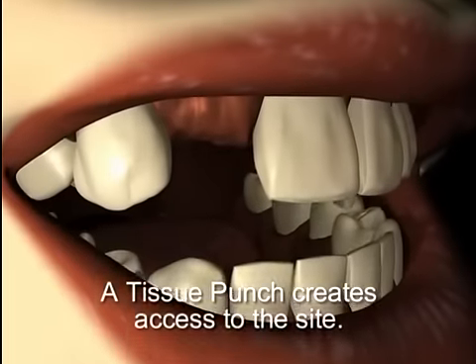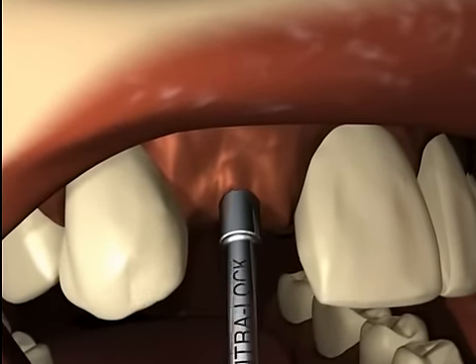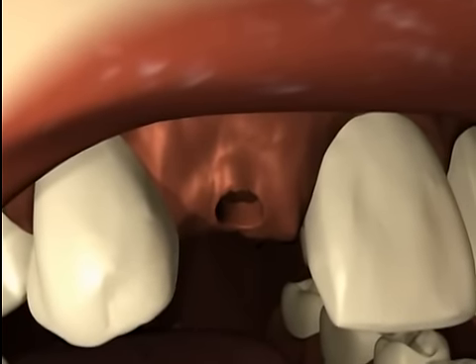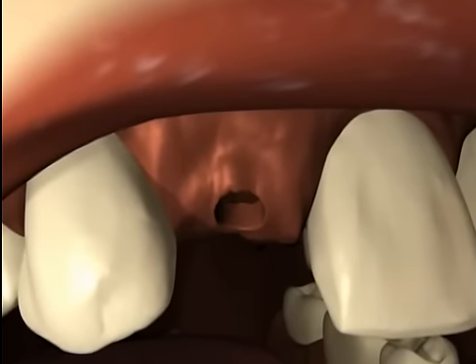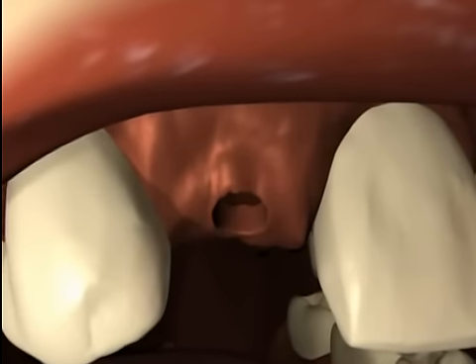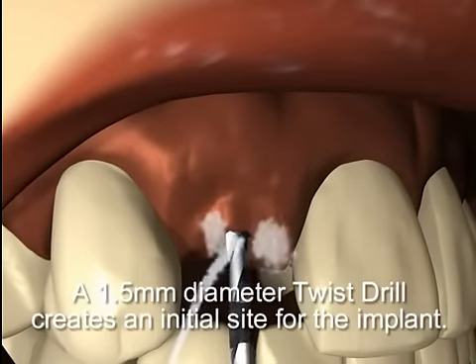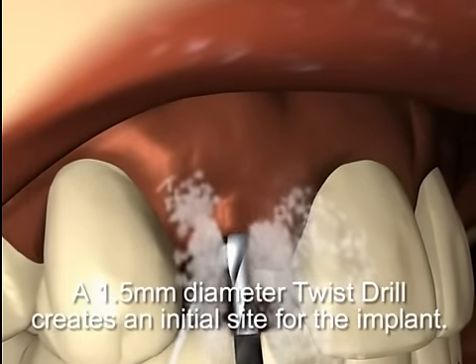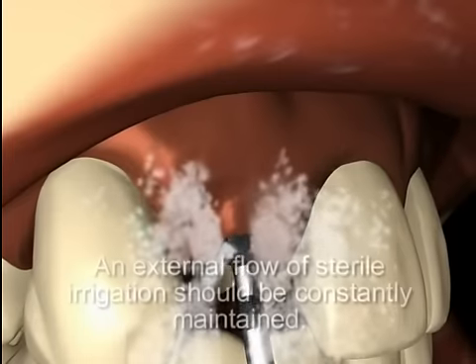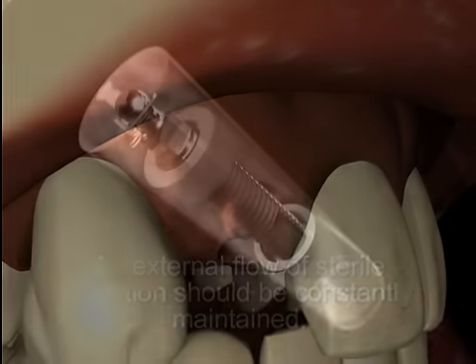A tissue punch is used to penetrate the soft tissue at the osteotomy site. When thin, porous, or irregularly contoured bone is encountered, or when gingival manipulation or grafting is necessary, a full-thickness mucoperiosteal flap should be reflected. The 1.5 millimeter diameter twist drill at 1,000 to 2,000 RPM creates a precise initial site for the implant. An external flow of sterile irrigation should be maintained.